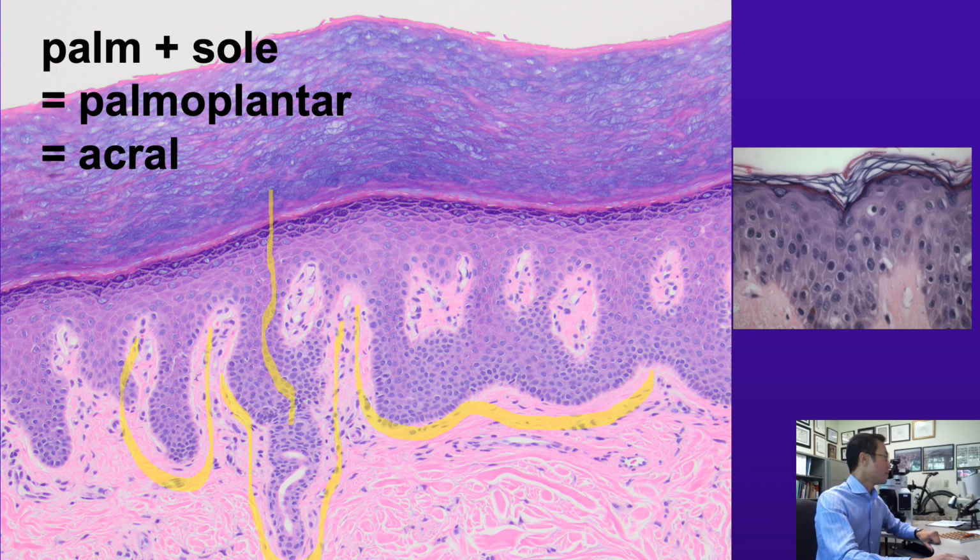We also have some blood vessels in the dermis, collagen fibers, these pink fibers, and empty white spaces in between that presumably represent some interstitial fluid and a little bit of mucopolysaccharide or mucin, as well as sparse spindle cells that represent a combination of fibrocytes and dermal dendritic cells for the most part.